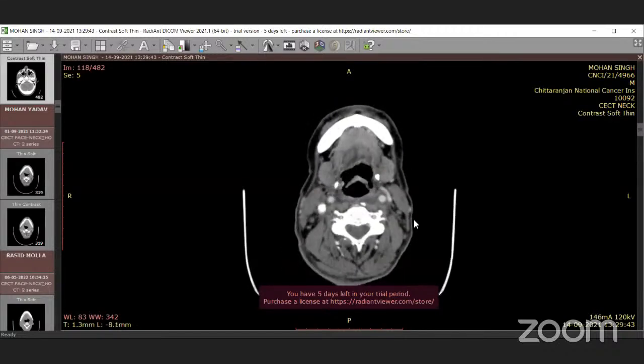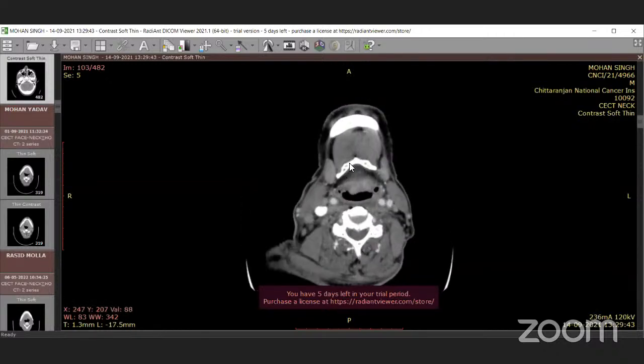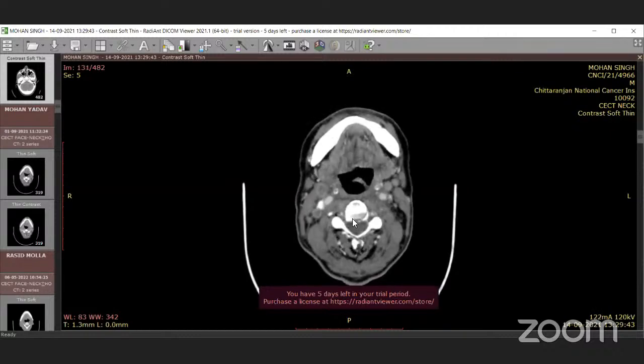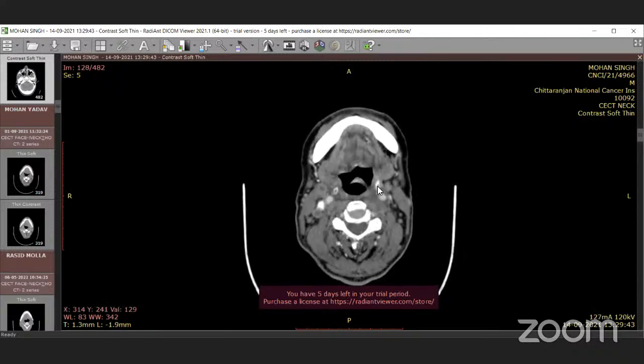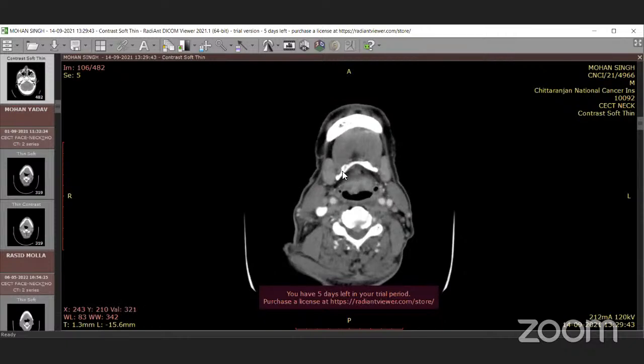Yeah. So hyoid bone is the first bone below the level of the mandible that we see. So this structure is the hyoid bone, the body. And as we go posteriorly and superiorly, this is the greater horn or greater cornu of the hyoid bone, the most posterior and superior part of the hyoid bone. The lesser cornu is not always visualized properly. This bump in the cartilage bone is the lesser cornu of the bone.